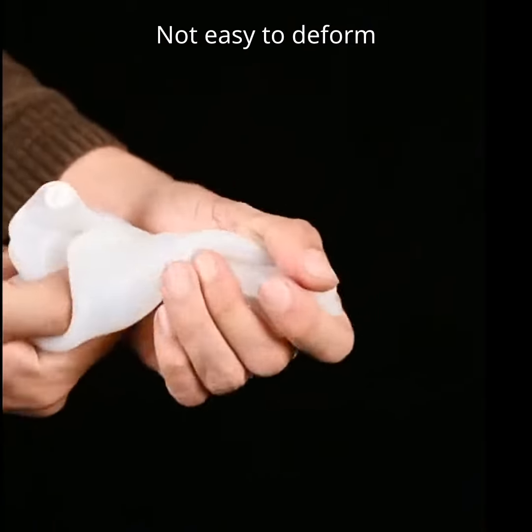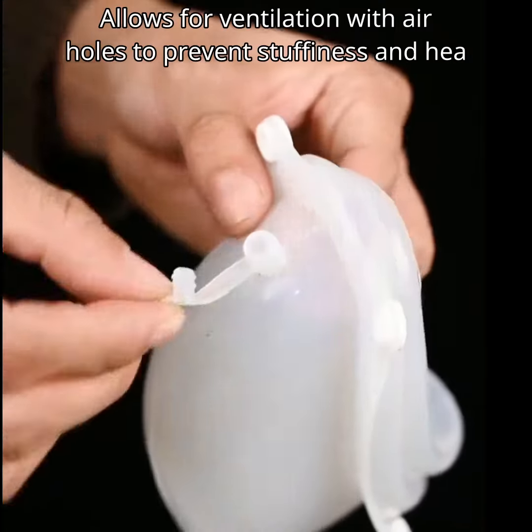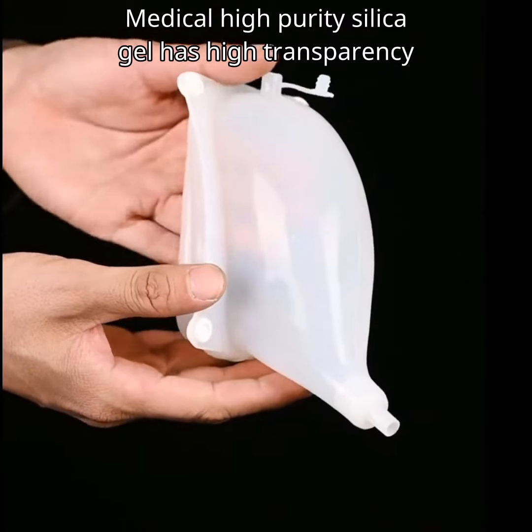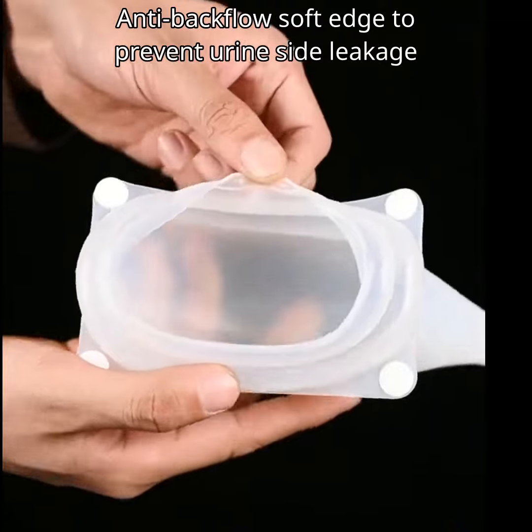Not easy to deform. Allows for ventilation with air holes to prevent stuffiness and heat. Medical high purity silica gel has high transparency. Anti-backflow soft edge to prevent urine side leakage.